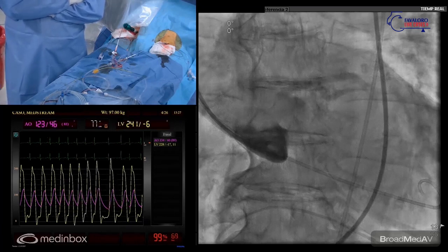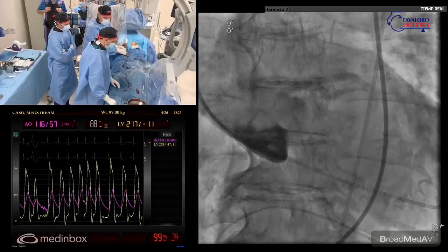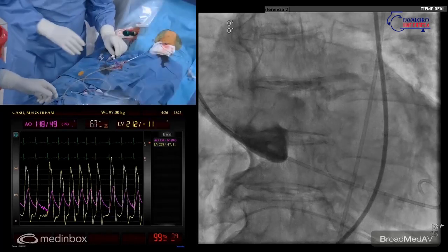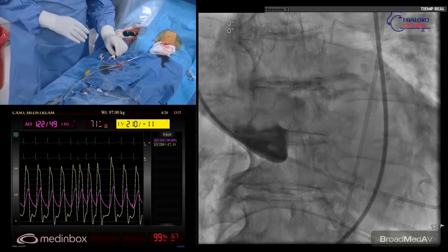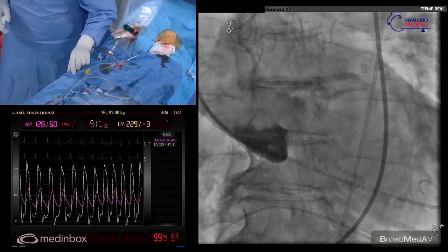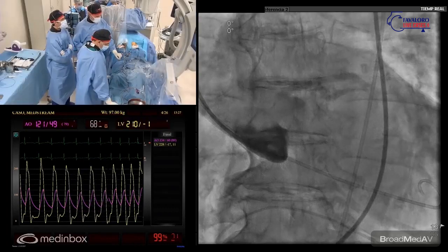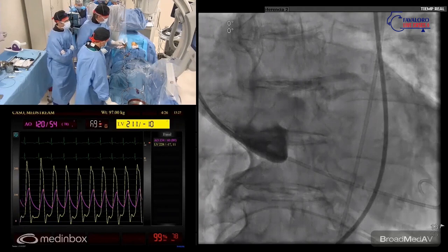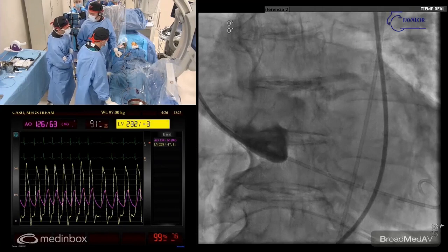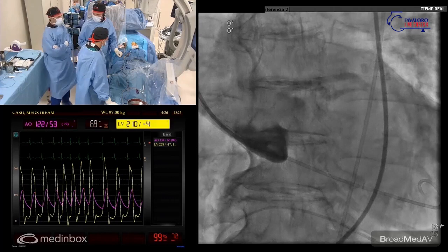The other difference to Oscar is that we use the radial approach as the secondary access. So we use radial and femoral. We don't leave any wire and we don't control the femoral access angiographically, nor with ultrasound. So it's just clinical: if we see that we have a good seal, we just remove the wire at the end when we close the ProGlide. If it doesn't close, we can use a second ProGlide at that time. It's not very comfortable to use a second ProGlide afterwards.